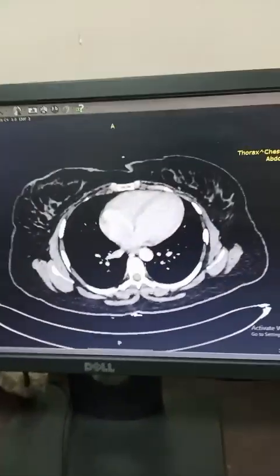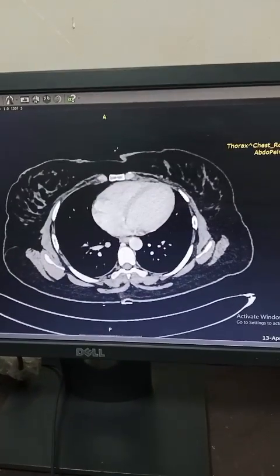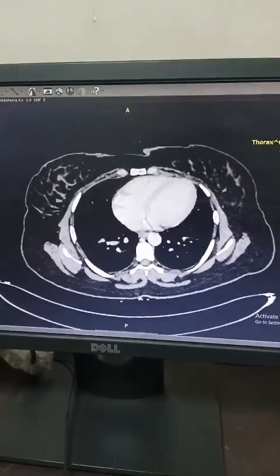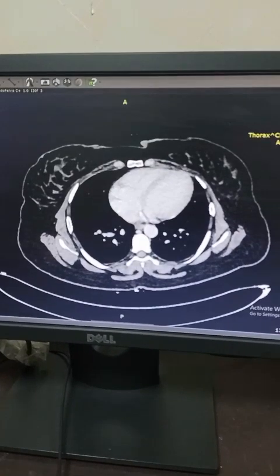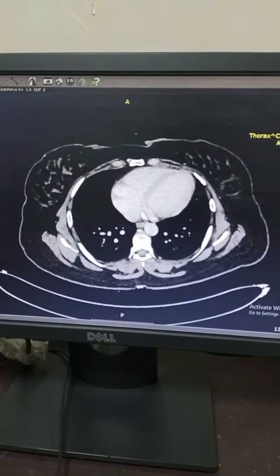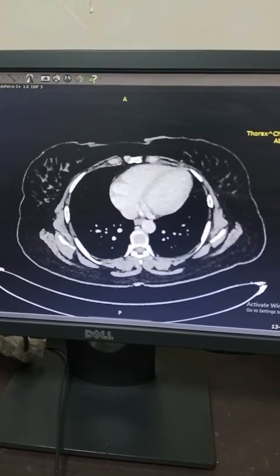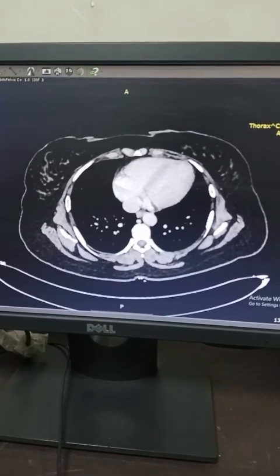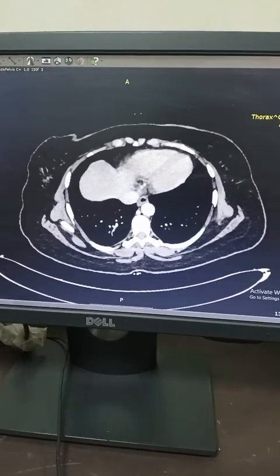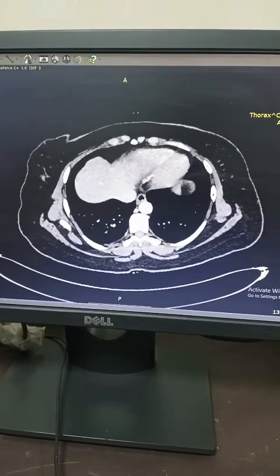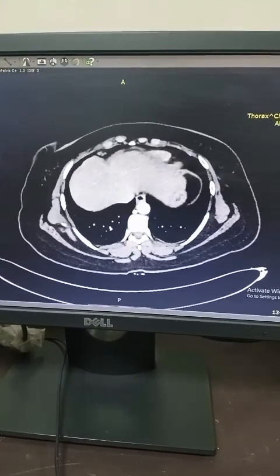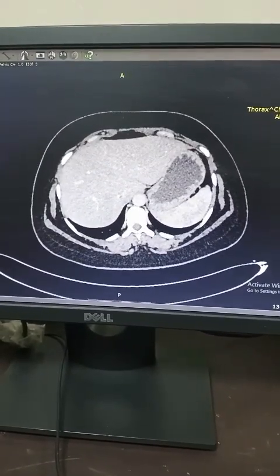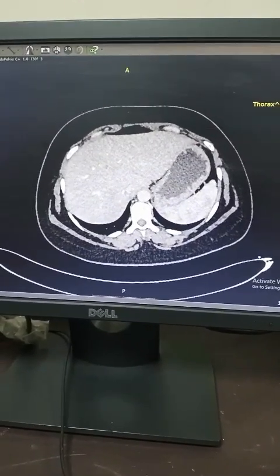Hello and welcome to another interesting video of my YouTube channel Medical Radiopedia. This 32-year-old female patient presented with a history of lower abdominal pain and paravaginal bleeding for two months after C-section.